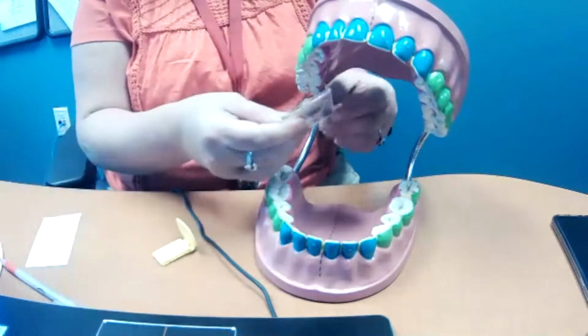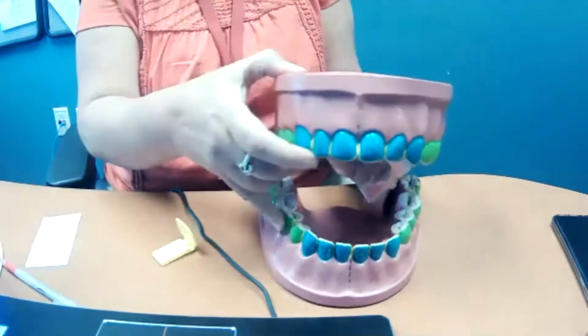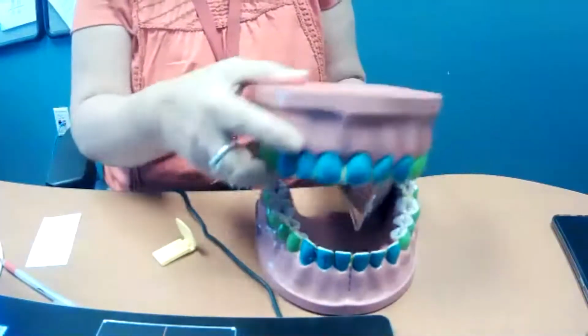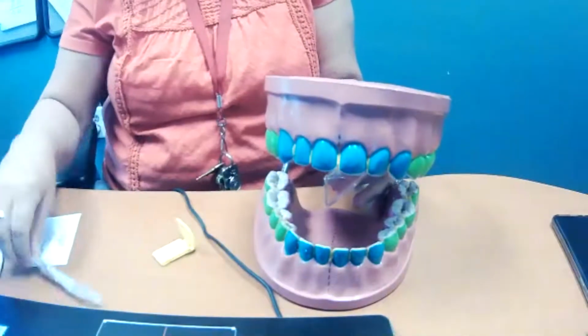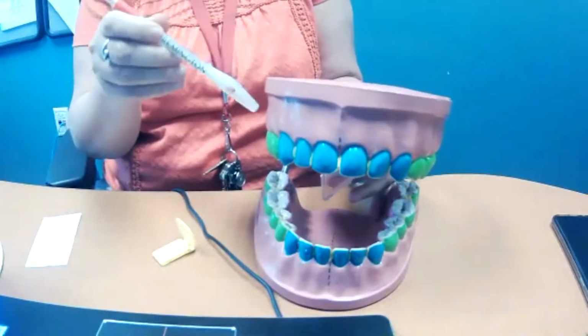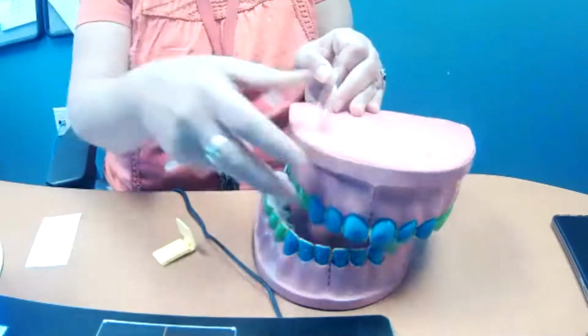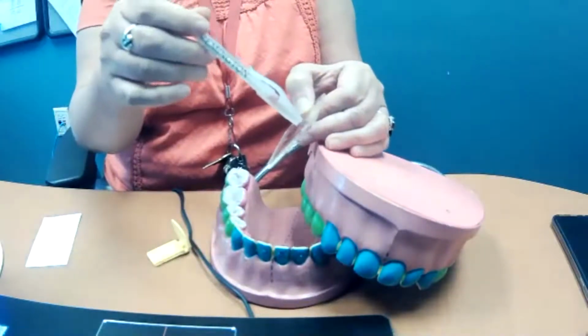So that being said, if your film is in your patient's mouth like this, and now we have a PID that comes up here, we always have to make sure that our PID is perpendicular to our film, right?